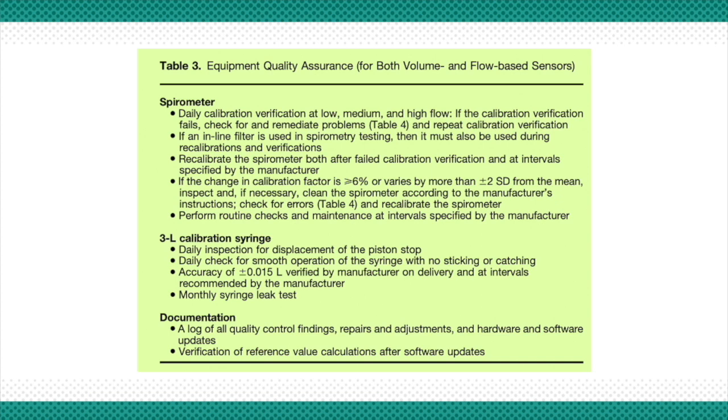There are strict criteria for addressing calibration and standard of the spirometer before actually interpreting the test. Lately, there were a lot of spirometers which would claim to not require any calibration, but the guidelines have really strictly laid down that all spirometers must be calibrated, and this is important to be done daily with a daily log. And once you do that, you can assure that the readings and the values are more accurate.